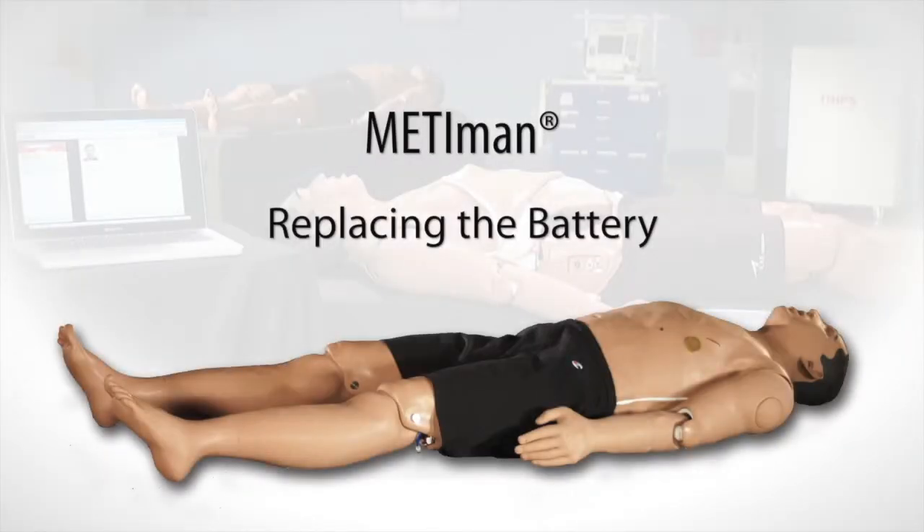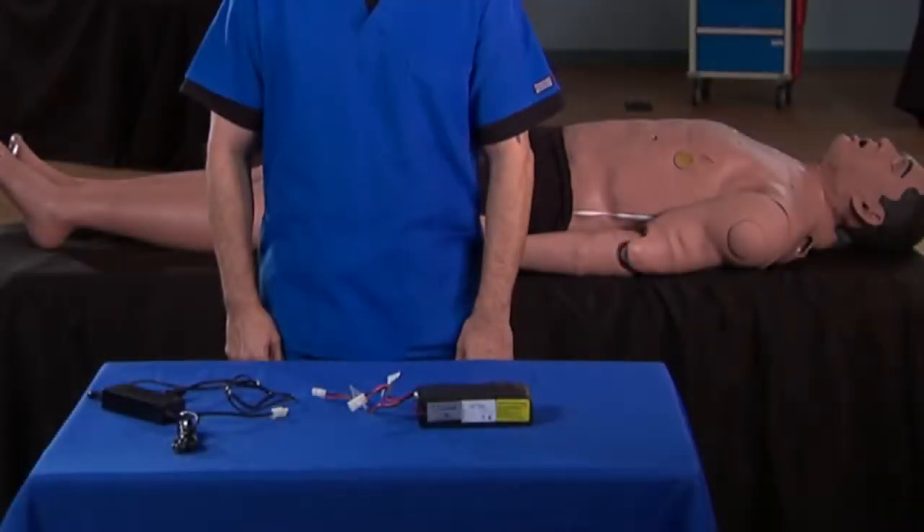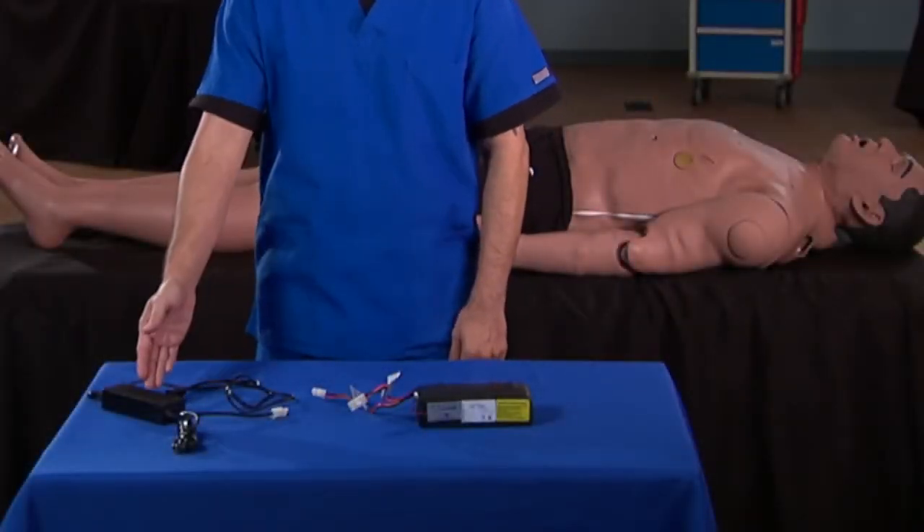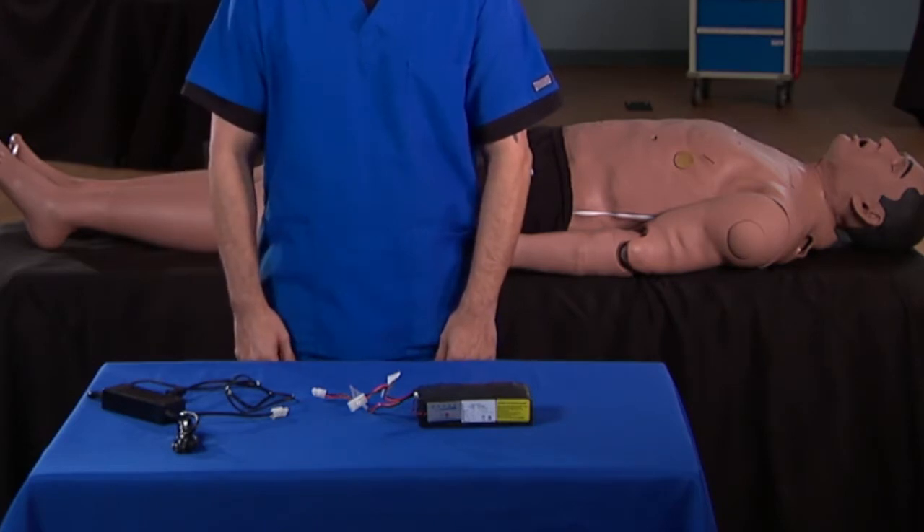This video shows you how to remove and replace Mediman's battery. Here's what you'll need: a fully charged battery, and the battery charger from Mediman's inventory kit.